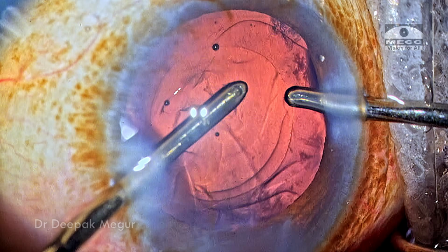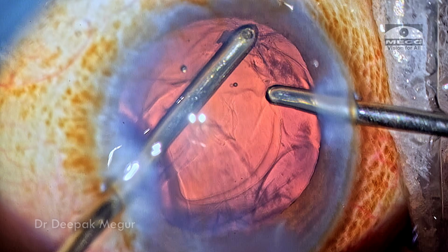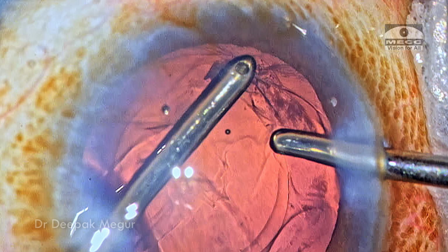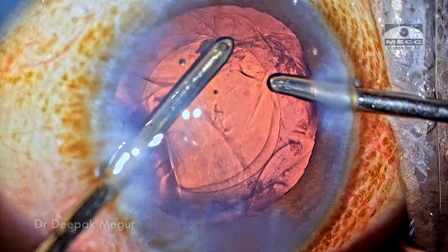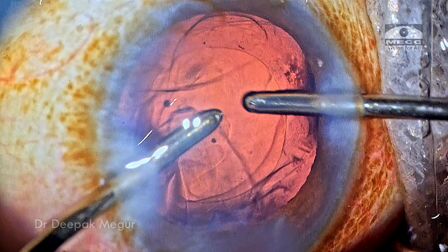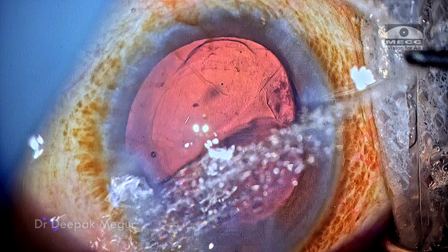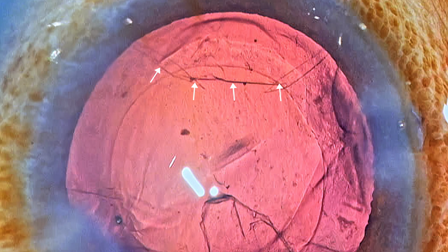The first chunk of cortex is out, and as I try to go a little deep into the fornix, the bag gets caught in the aspiration port quite easily and is trying to come out. I push reflux and disengage it, and as the IA cannula is removed, the eye becomes soft, and suddenly we can see this classical wrinkling of the posterior capsule. It is more prominent in the distal half. Only in the distal half you can see these wrinkles which are extremely prominent.